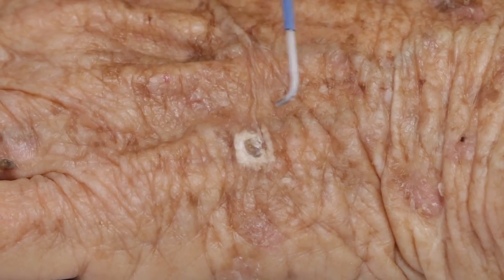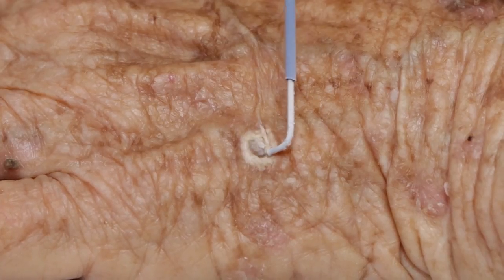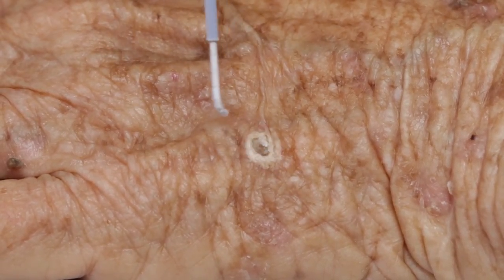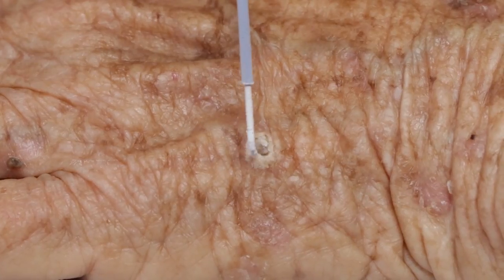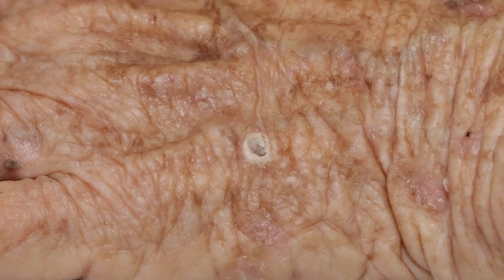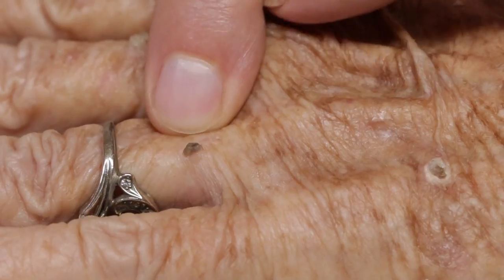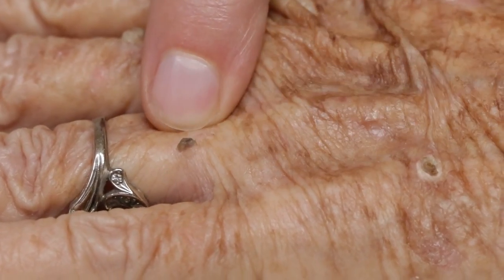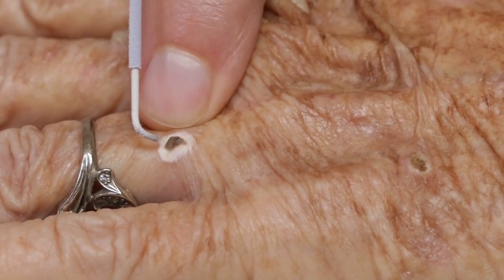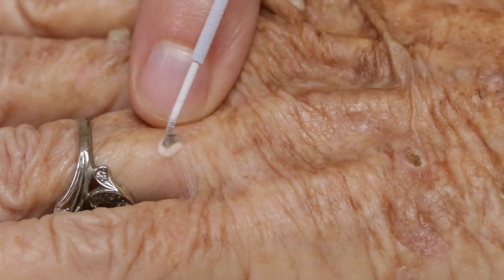We'll start with this one — we're freezing it by spraying liquid nitrogen right onto it, this is really cold stuff. I'm going to try to get it over on this side too because it's kind of blocking the stream a little bit. We like that to stay nice and white and frozen for about 20 seconds or so, and then we come back and we'll do it a second time. But while we're waiting for that to thaw out, we'll go over here to get this one that's kind of near your ring. That's another one — we'll get them both. You can see we're getting the whole area plus a little bit of surrounding collar.